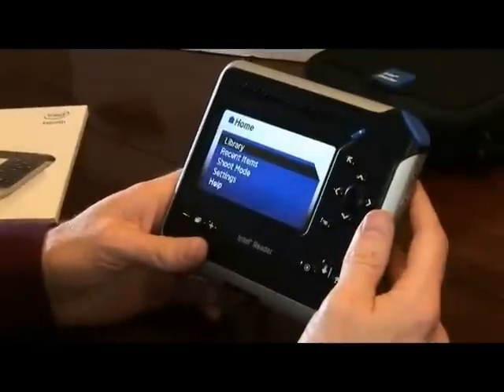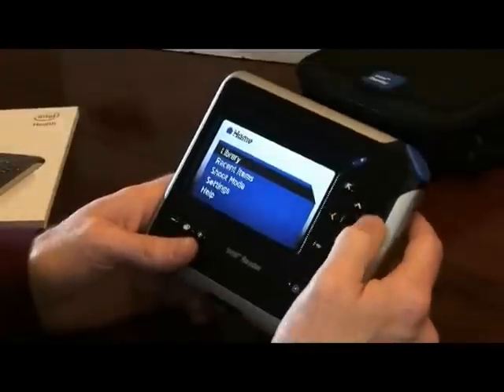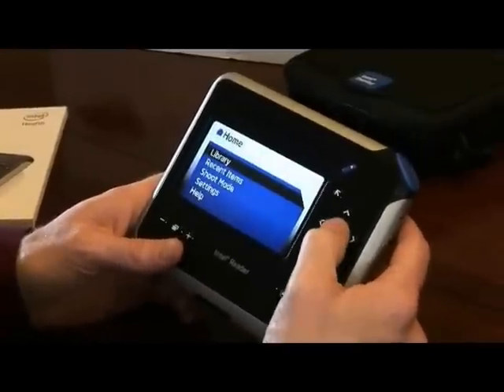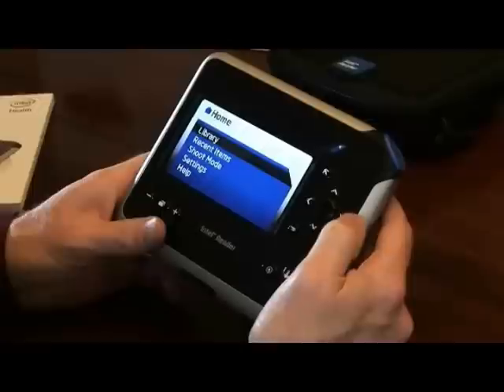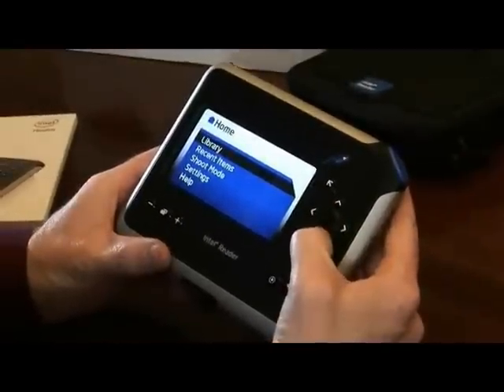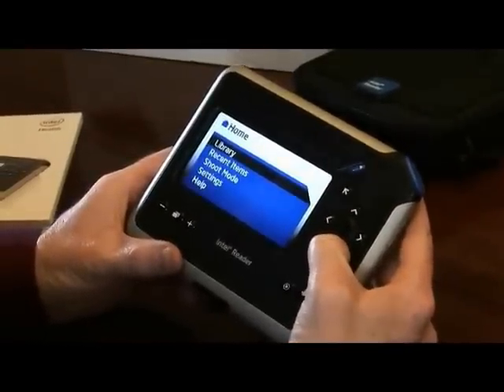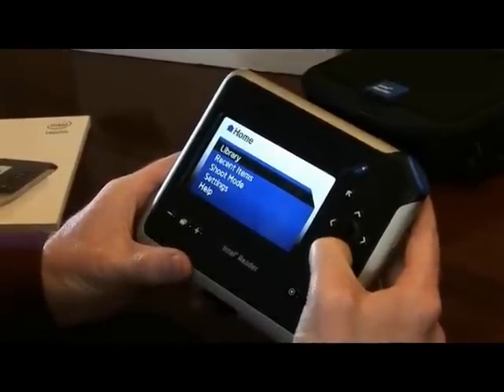Once you've got the Intel Reader booted up, you want to familiarize yourself with the basics. You should start with the directional control pad on the right. The home key, which is your central key, is the one that you use to select items. You then have up, down, right, and left. An important fact to know is that inside the help menu is all of the material that's in the help guide in the manual that's available with the device.